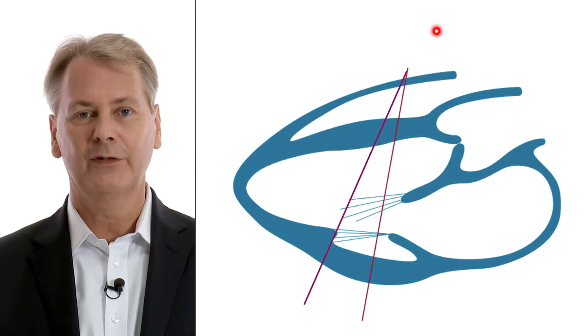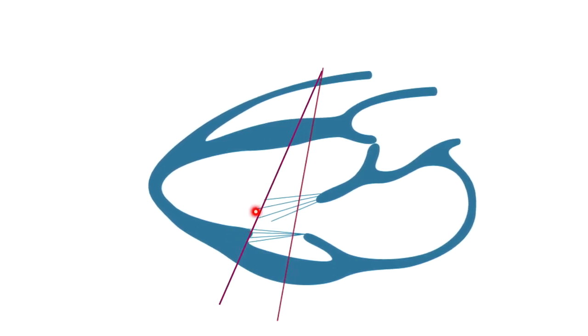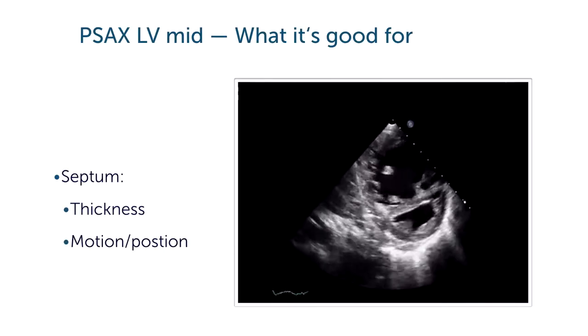This is just to demonstrate why we get an oval shape of the ventricle, because we're cutting through the ventricle more oblique. So the distance here will be longer than the distance would be if we really cut the ventricle perpendicular. The short axis view is ideal to look at the septum and the position of the septum.